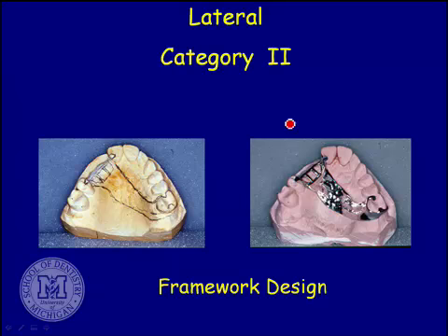Depending on how a tooth is tilted, if this is true north and south, and the tooth is tilted this much, or more severely this much, and you've got your strap in there, if you're touching at all at the marginal ridge, even if there was more undercut than you could use, and you block part of it out so that your framework fits like that and engages a little, as long as it engages at that marginal ridge coming around the corner a little bit, this tooth cannot tip easily because it's got a block there.